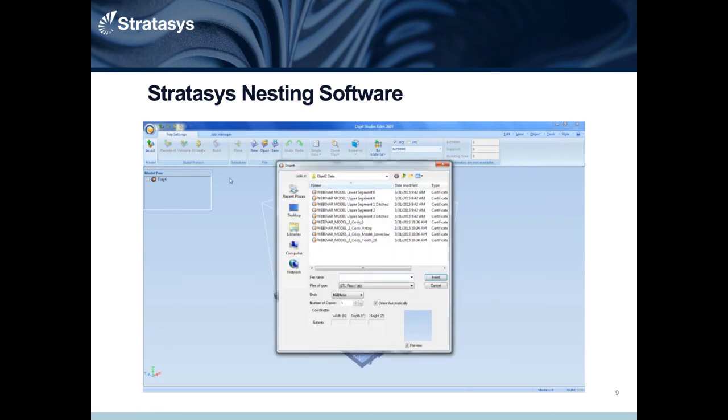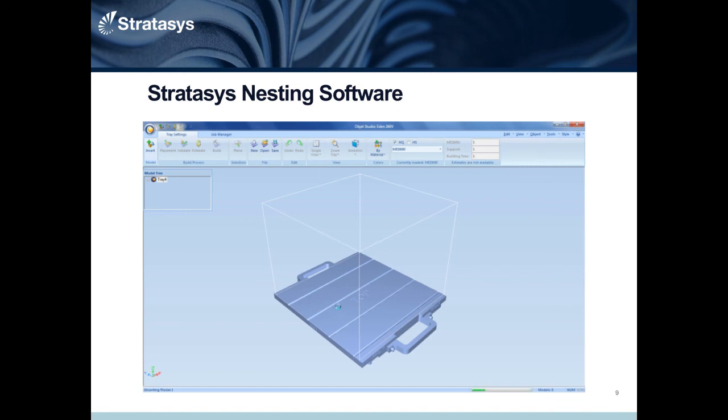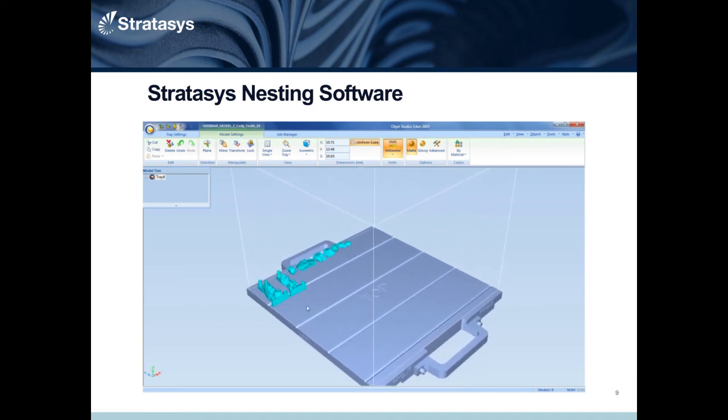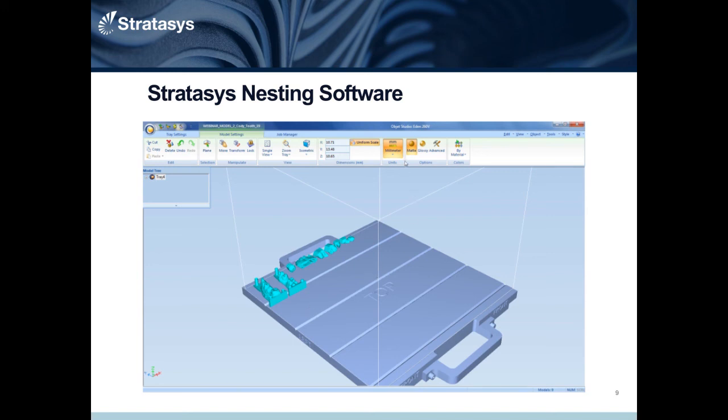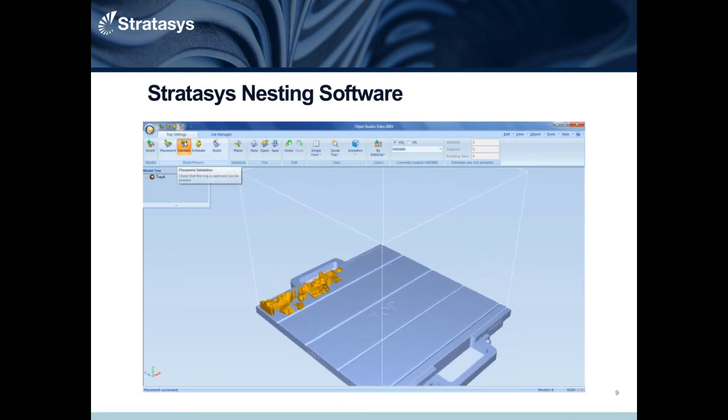So once you have all the pieces that are going to be printed, you build a tray and you can bring the pieces onto a tray either individually or you can bring multiple pieces in at one time. You want to make sure that your settings are right. We use high quality matte for all of our printing. Seems to have the best result, most accurate result. You can do a high speed as well if necessary. So then we'll click on placement and it will auto place the pieces for the shortest amount of print time.